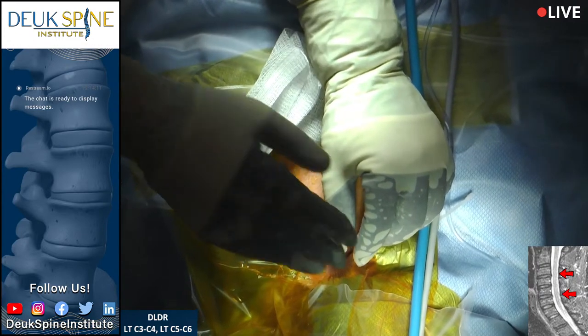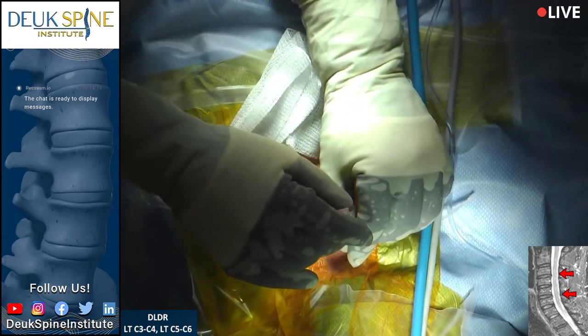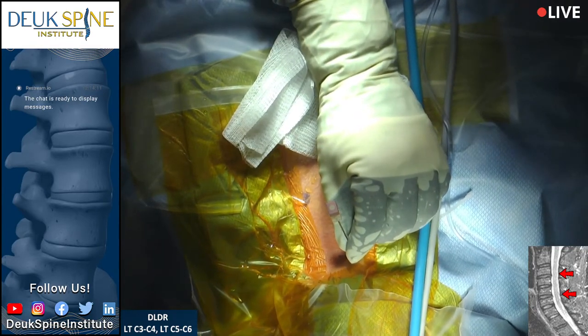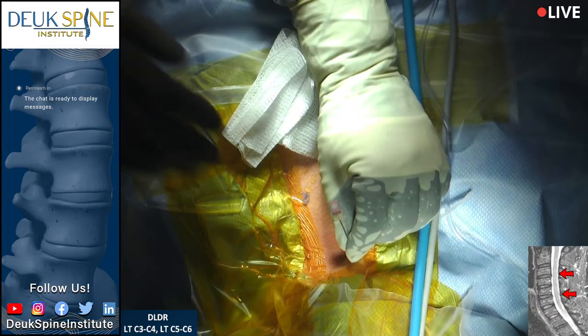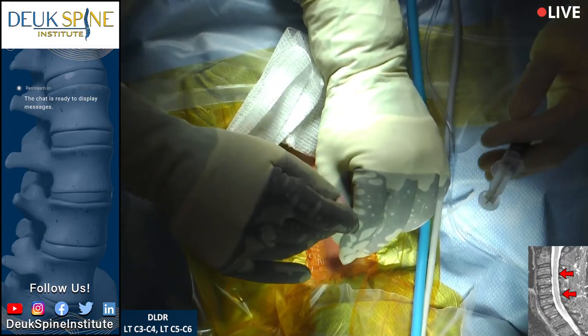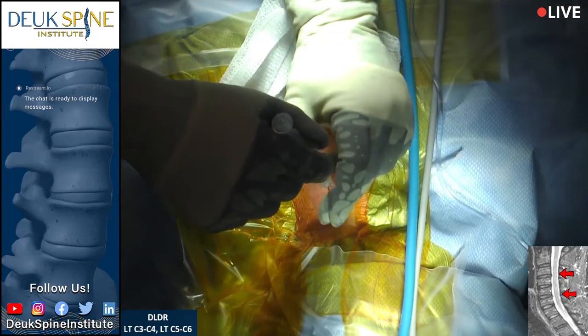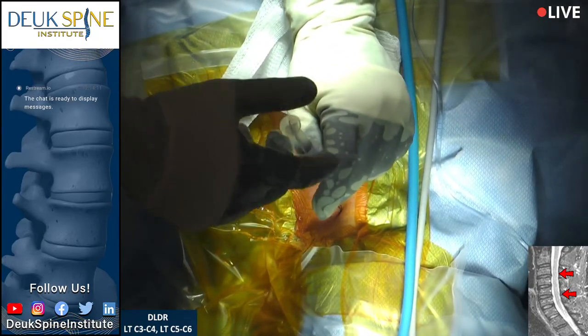We're getting ready to do the second needle. I'm going to place this needle and we're going to do our discogram at C3-4 to look for the tear and to stain the herniated nucleus that is degenerated blue.